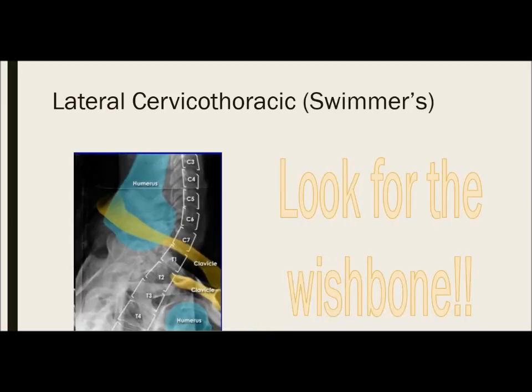A little trick that you can use to make sure that you have it properly positioned is you can look for the wishbone with the clavicles. See, here's one here, and then this one here. So that would be your wishbone on your image, and that would be a good image there. It's just a little trick.